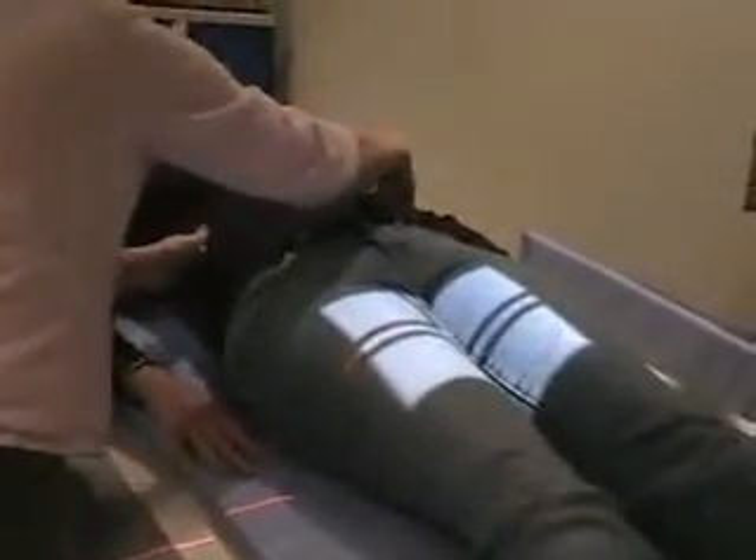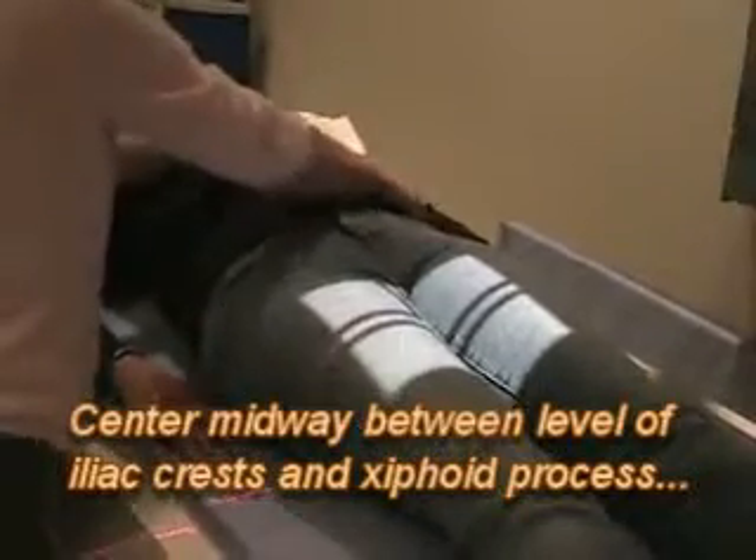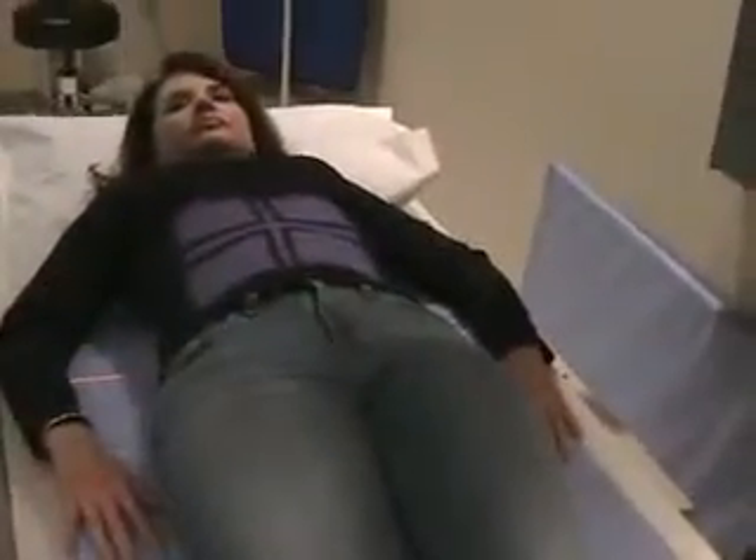Just for the kidneys, we're going to be halfway between the iliac crest and the xiphoid process. There is the iliac crest — I would want to be somewhere in between there. That will be midline, midway between. We have the top of the crest at the bottom of the film, so you're midway between the crest and the xiphoid process. This would be like if you were doing the IVP or IVU, and maybe this is immediately after injection — you want to see the kidneys filling up, so you would do just the localized kidney film.